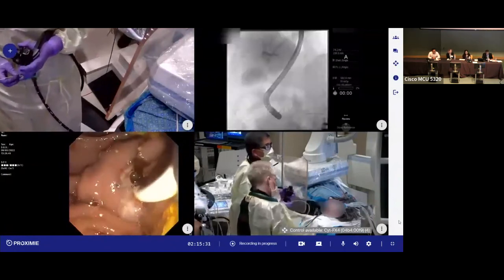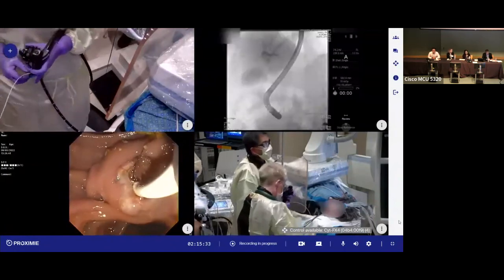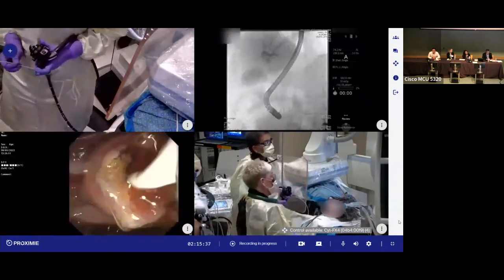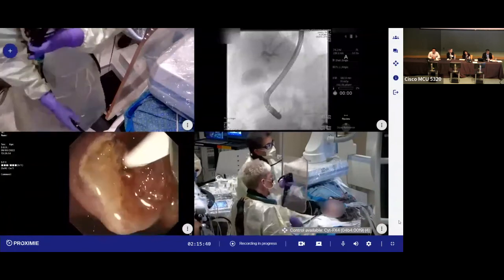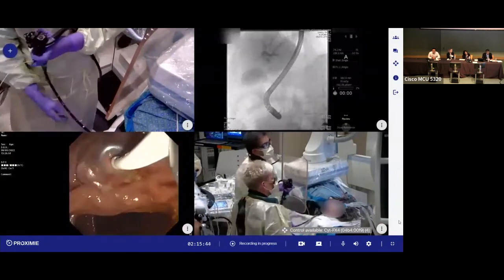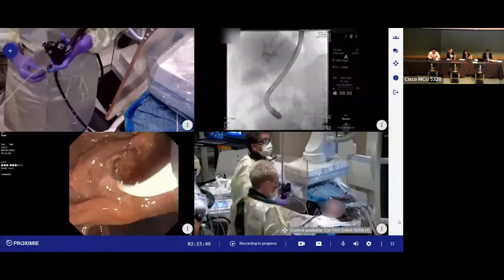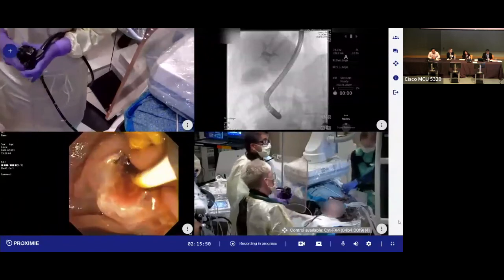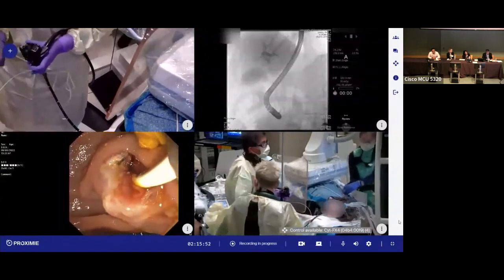When would you place a covered metallic stent? Oh, I'm so glad somebody asked that. I think covered metal stents for difficult biliary stones are so overused. I don't routinely do that; I balloon down. If there's a difficult stricture downstream and you're trying to treat the stricture, it might be a strategy, but I wouldn't look at it as a sole strategy.